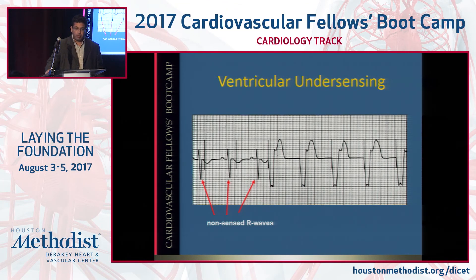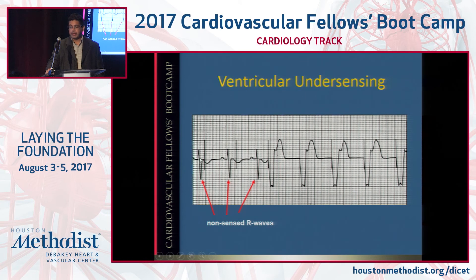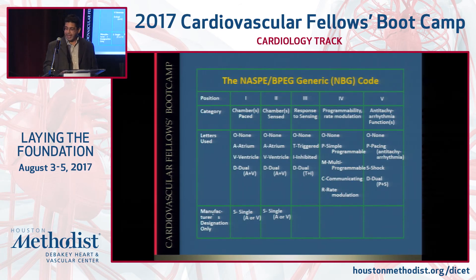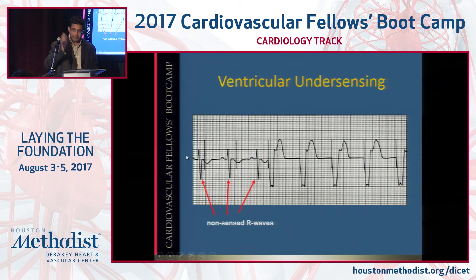Under-sensing leads to over-pacing — a failure to inhibit. Over-sensing means sensing signals that shouldn't be there, which inhibits pacing and results in too little pacing. Under-sensing means failing to sense signals that are present, usually leading to too much pacing. Here, there's a narrow QRS that should not be followed by a pacing spike, but is, because the pacemaker did not recognize the presence of that QRS. The sensitivity on the ventricular lead at a minimum probably needs to be adjusted. There's no problem with capture here — the pacing spikes that fire in the middle of ventricular systole simply don't capture because of the refractory period.